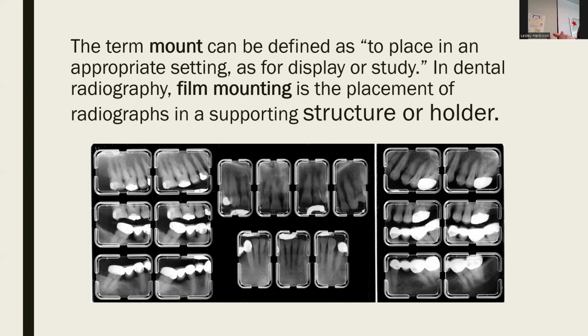Digital films do this for you. You notice that there's a sequence, and we can talk a little bit about our preferred sequence, but you'll notice that it's already highlighting where it wants you to go. You can change that. You can say, well, I'd actually prefer to go here. So you can change it, but generally speaking, digital just mounts it for you. But we'll practice tomorrow with traditional mounting, so you can look at some films and actually mount them, practice mounting the traditional films.